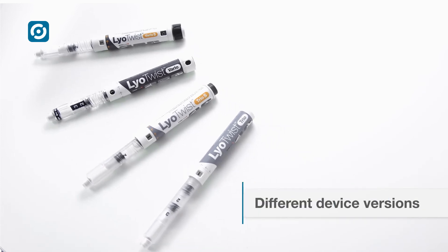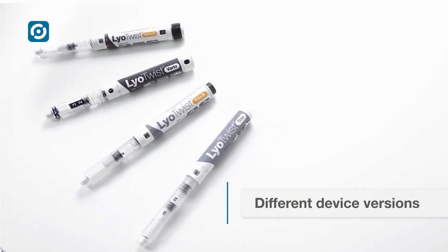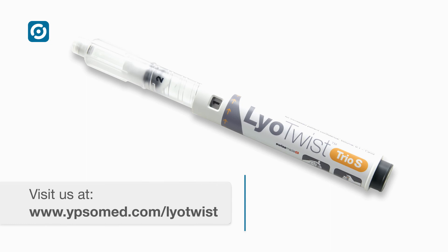The LioTwist device family includes versions for automated injection and variable dosing to accommodate a complete range of therapeutic needs. LioTwist — the intuitive dual-chamber device for lyophilized drugs.